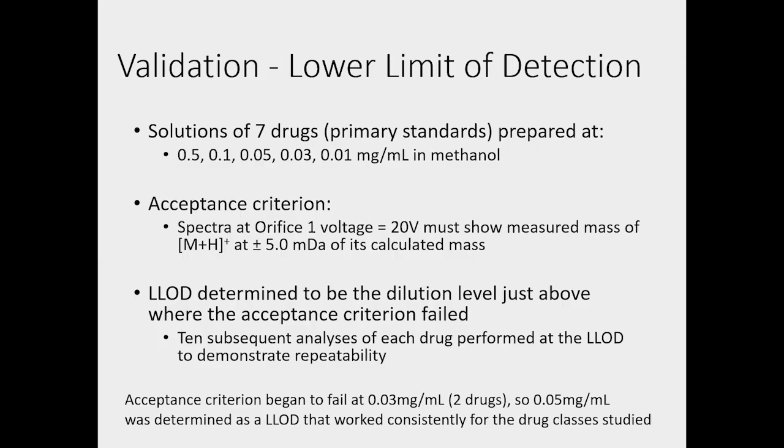So it's possible with the newer instruments that the lower limit of detection could potentially be decreased and have higher sensitivity. In addition, they also did this with function switching, which, as you've heard, has a lot of benefits, but it can potentially sacrifice sensitivity. So if you're very interested in increasing the sensitivity, you could focus on having only 1 voltage be analyzed.